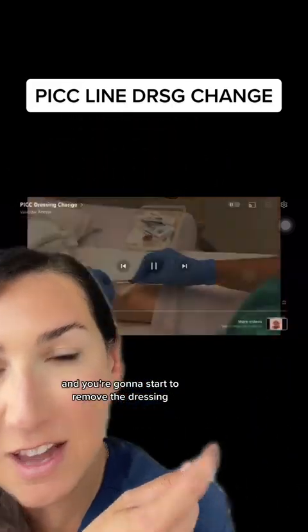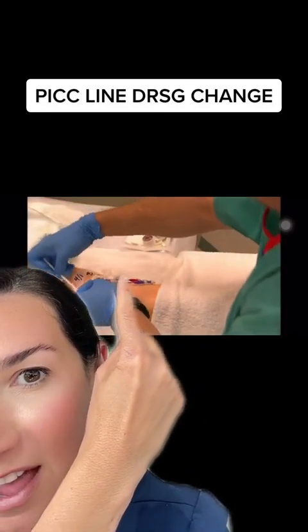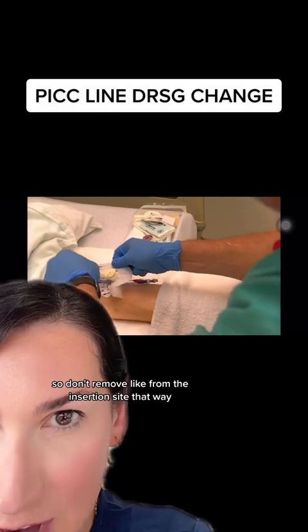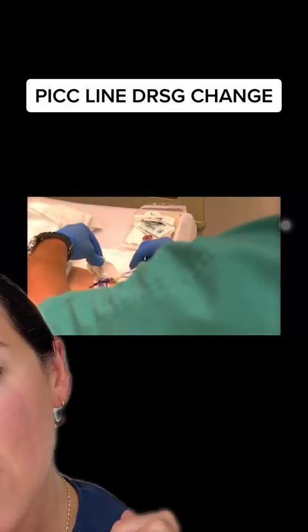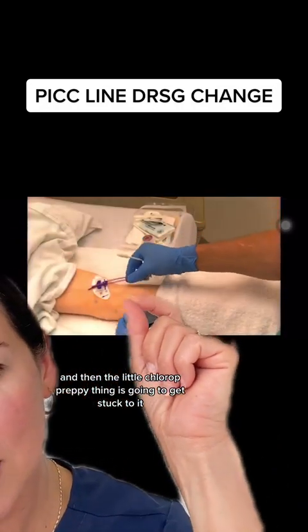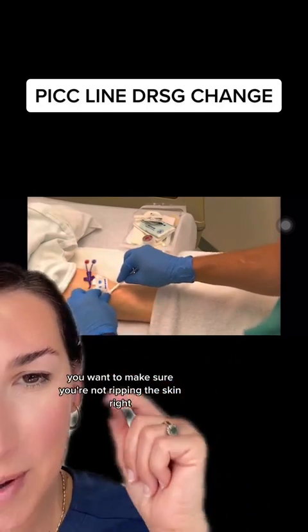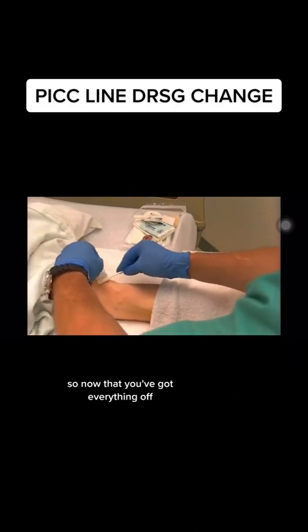Start to remove the dressing — remove the part closest to the lines first, then work away from the insertion site. Don't start removing from the insertion site outward; instead, remove from where the lines are toward the entry point. Remove it all. The little chloraprep piece may get stuck to it — that's normal. Now remove the stat lock, again being careful with the chloraprep applicators so you're not ripping the skin.